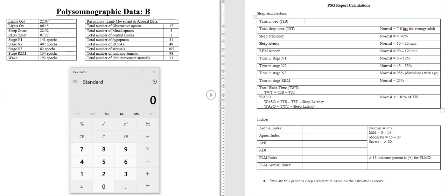And how I do that is just we're starting at 22:07, which is 10:07 p.m. So I would go 10 to 11, 12, 1, 2, 3, 4, 5, 6. So there's 8 hours. What you didn't see was me counting on my fingers. So that was 8 hours, and then just the difference in the minutes. So we can count forward 7 to 15, so 8 hours, 8 minutes. If you wanted to then convert it all into the same increments, we can do 8 times 60 to get to minutes, plus that additional 8, so that's 488 minutes.